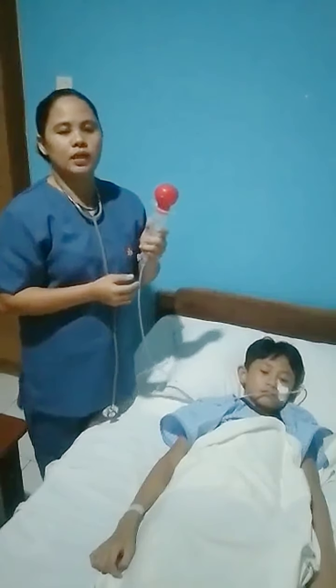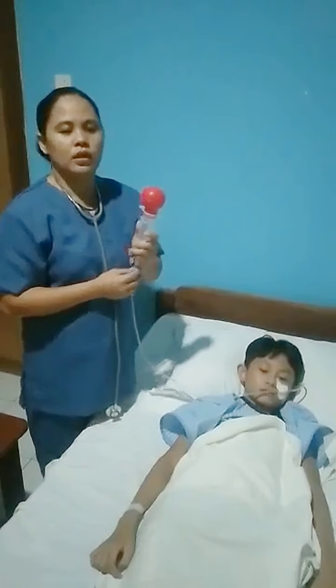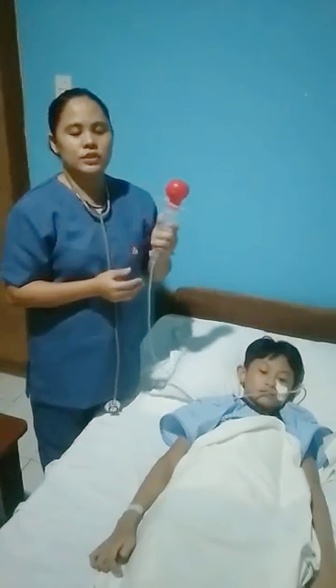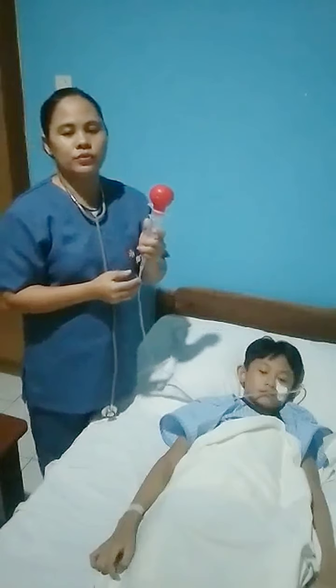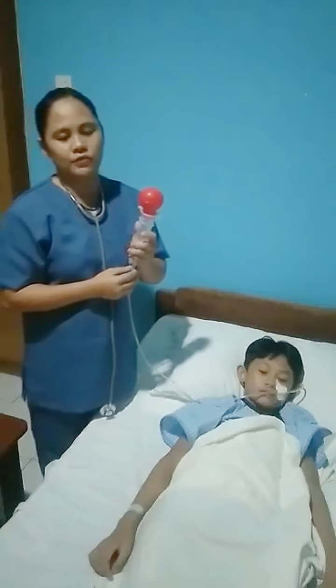That is to clear the blockage along the tube. The total water we have to flush is 30 ml. We have to do flushing three times: before the feeding, in between the feedings, and after the feedings.